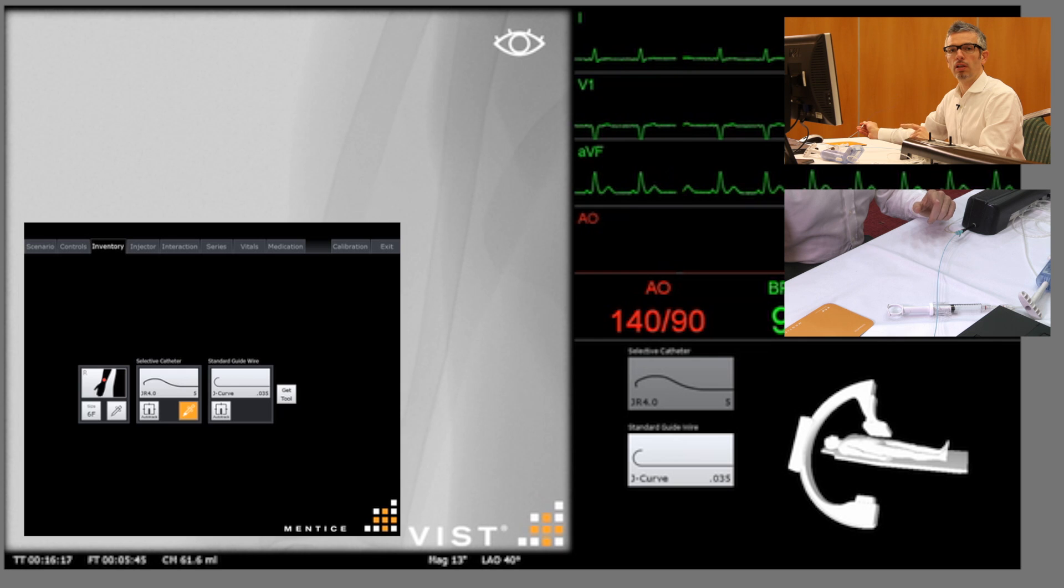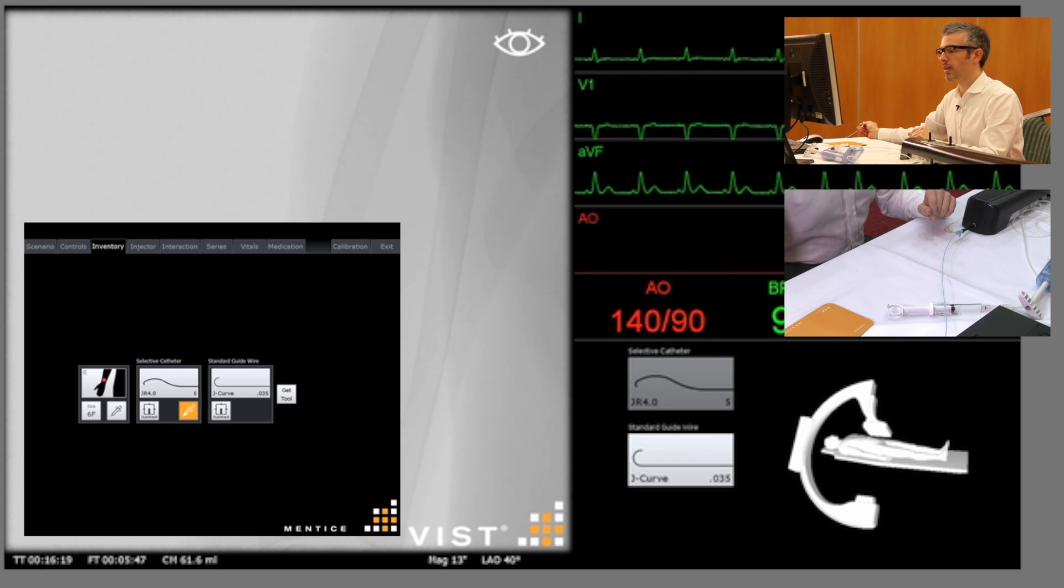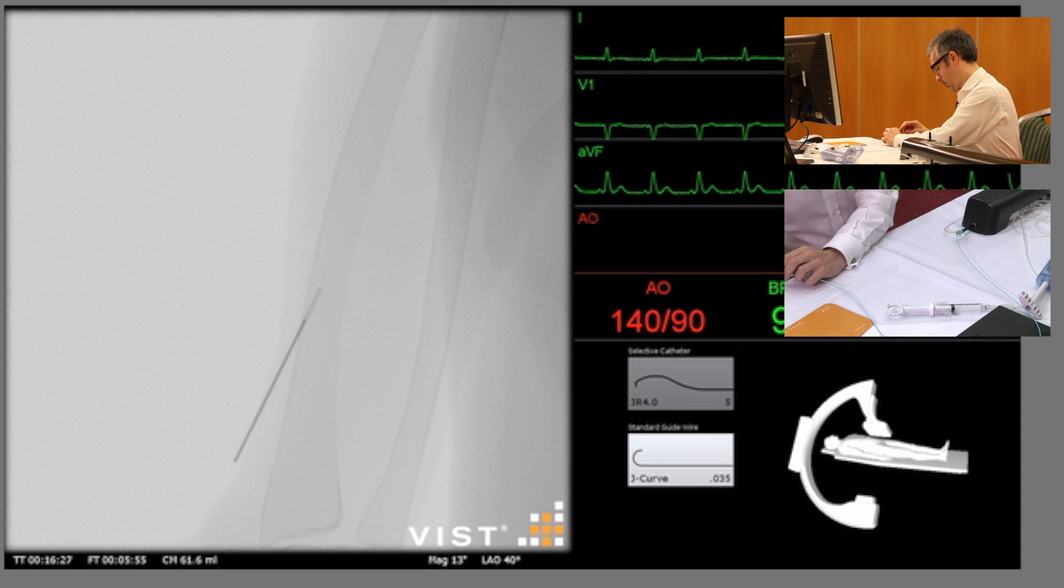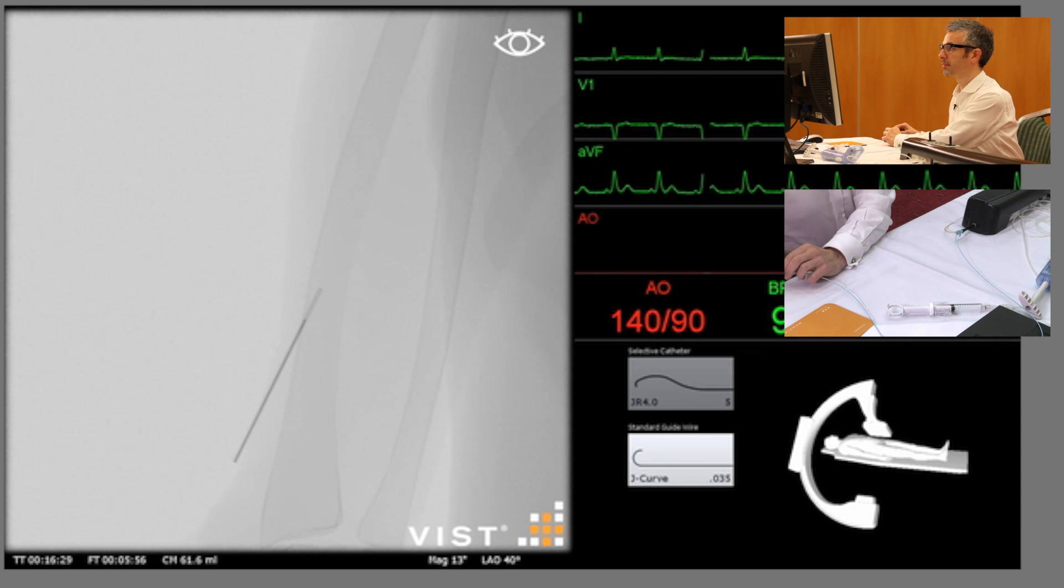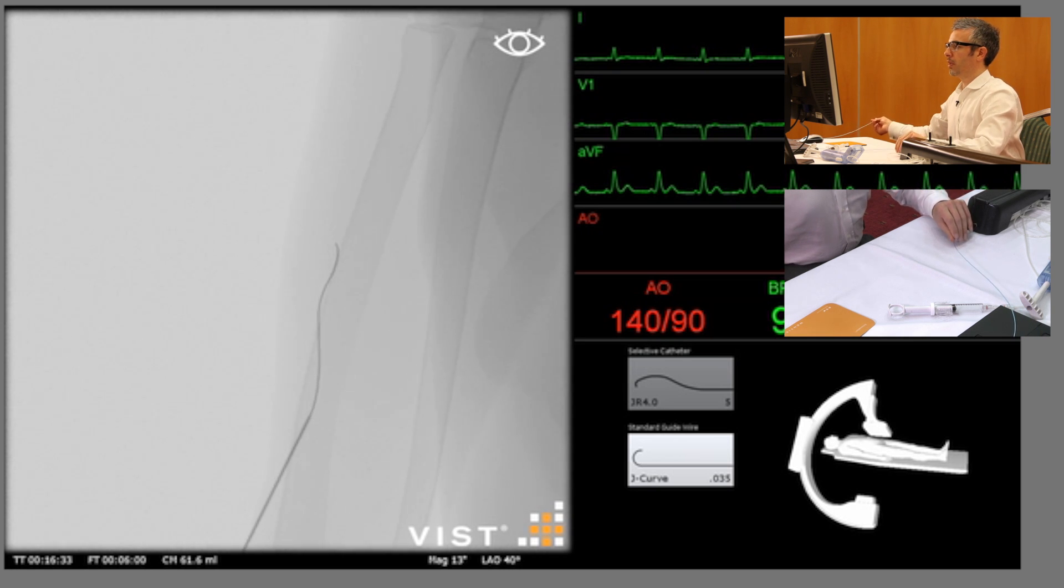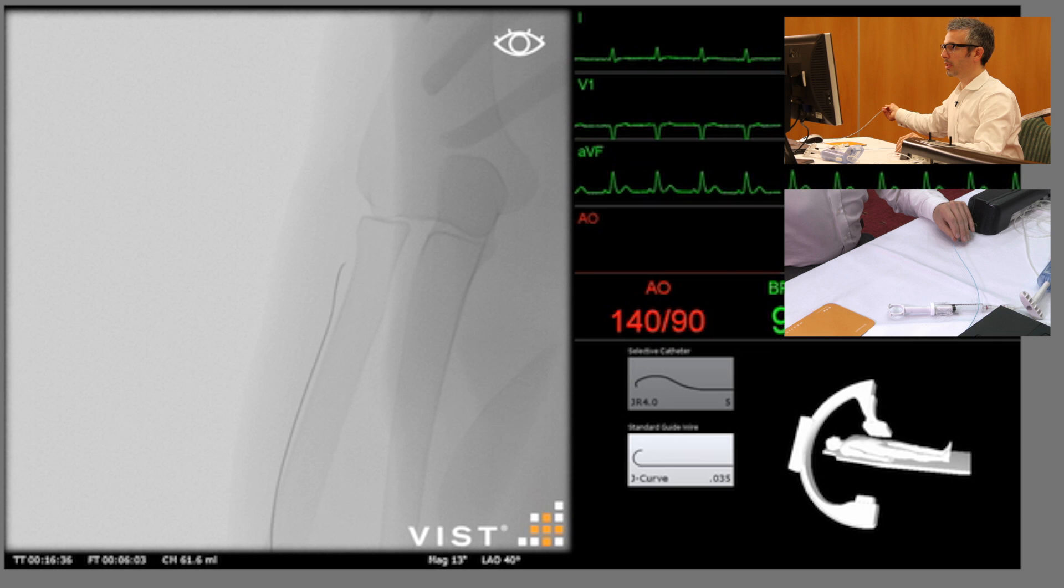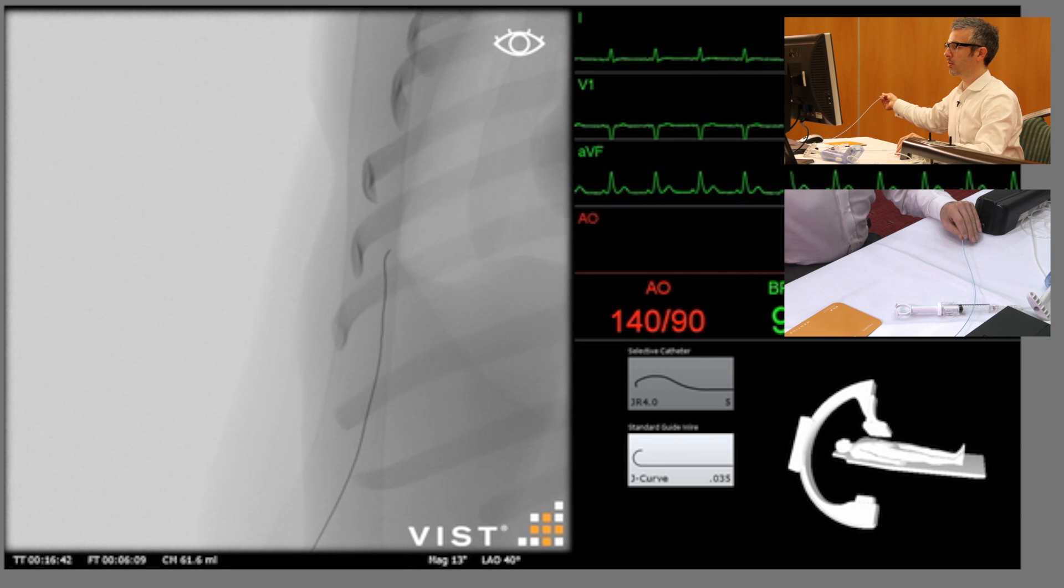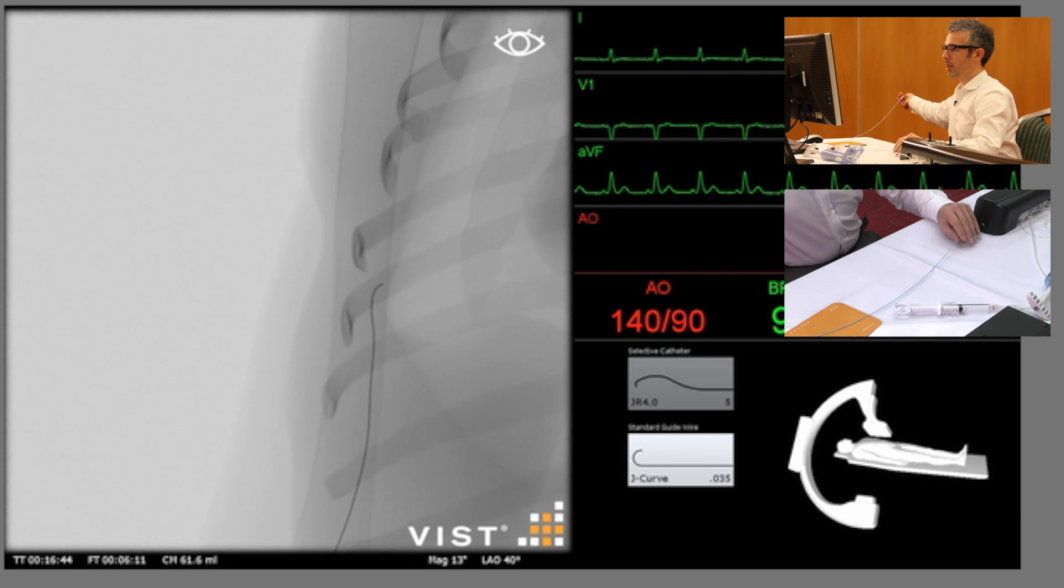To start with we've got our 035 guide wire sat inside the radial artery sheath. As we advance the guide wire we should have a mental picture in our minds of where the wire should be heading. So if we see it deviating from that pathway or if we meet any physical resistance then we know that we need to redirect the wire. In this case you can see that the wire is moving smoothly up the artery.